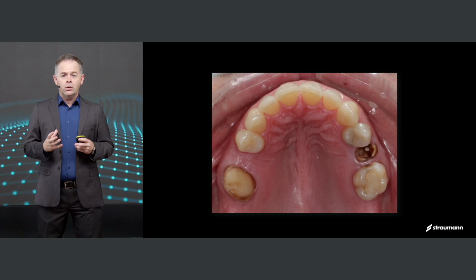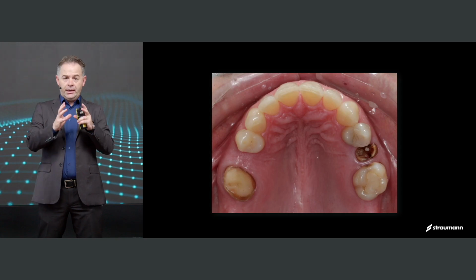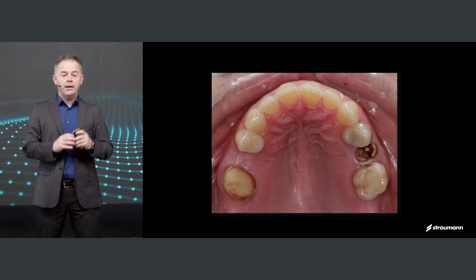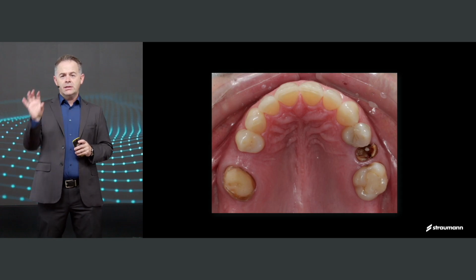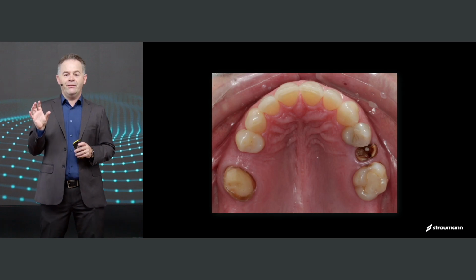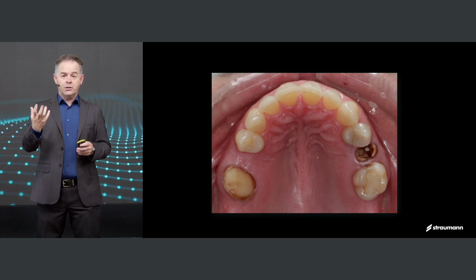We bring to a closer look, see how she has this shy smile because she knows she's already missing a premolar on the left side and a premolar on the right side. When we look at the occlusal view, you see clearly the number 15, it resembles a healed site, but hold on, I have a surprise for you there. And on the other side, you have tooth number 25. That is already a hopeless residual root. It needs to be extracted.